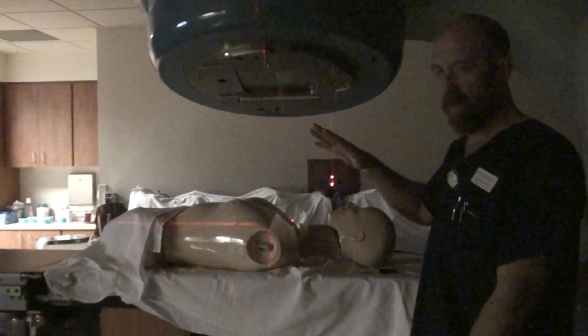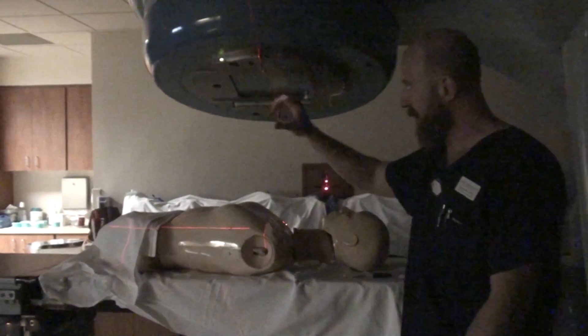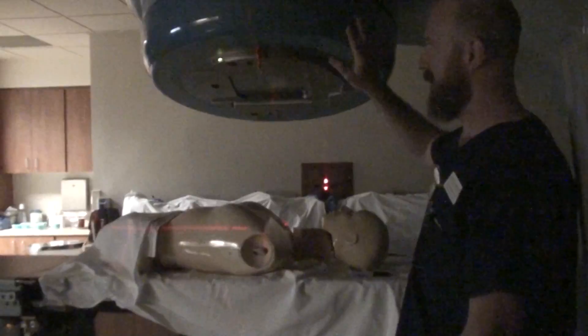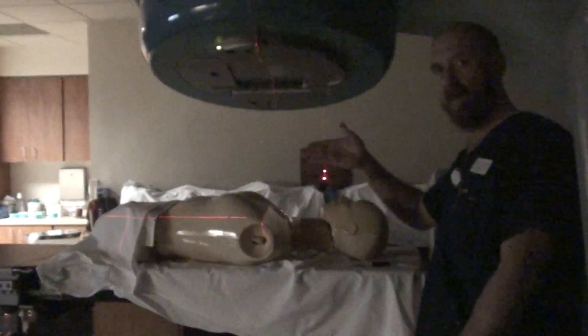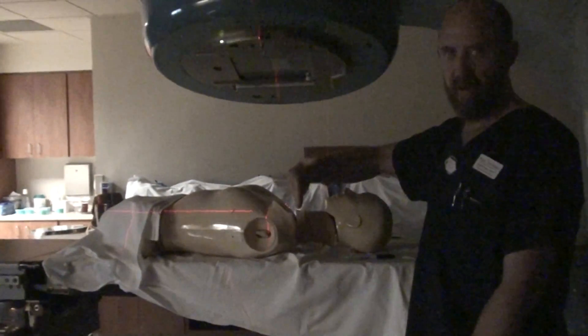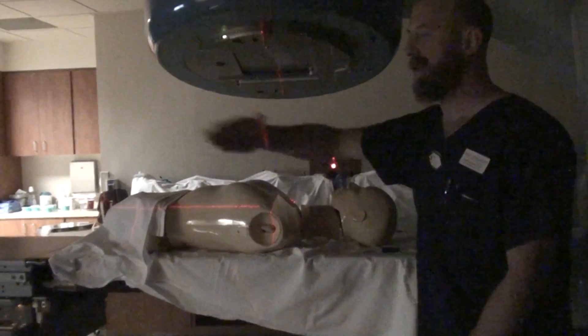We are dealing with three kinds of divergence. We are getting rid of divergence on the inferior edge of the anterior by closing down the jaw. We are getting rid of divergence from the medial aspect of this field by moving the gantry over. And we are getting rid of the last divergence — contributed from the superior edge of the medial side and the lateral tangent — by kicking the table.